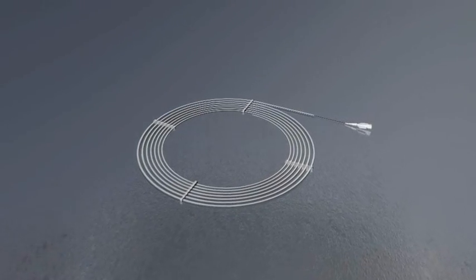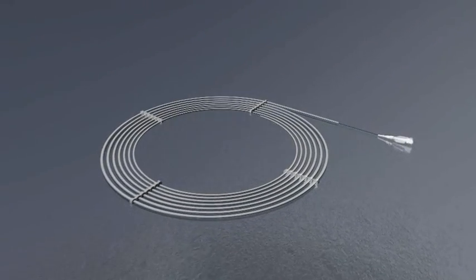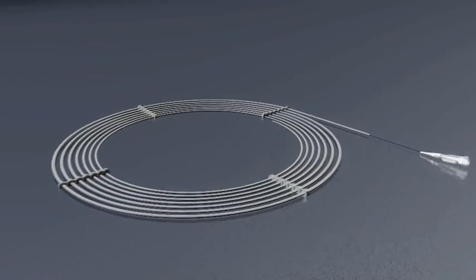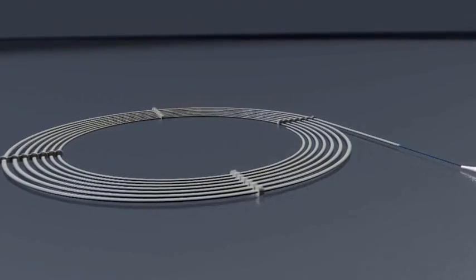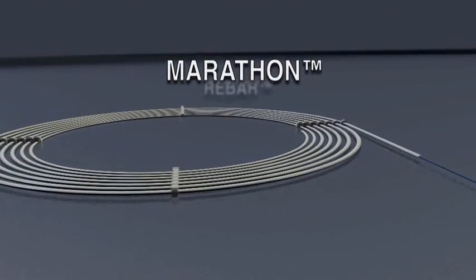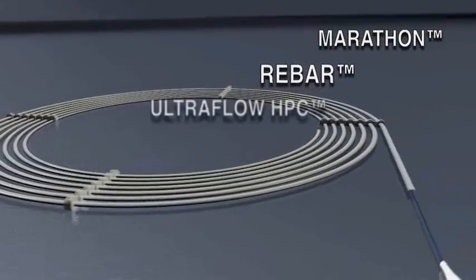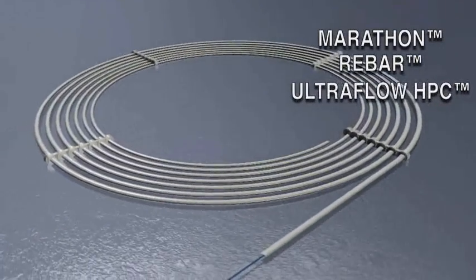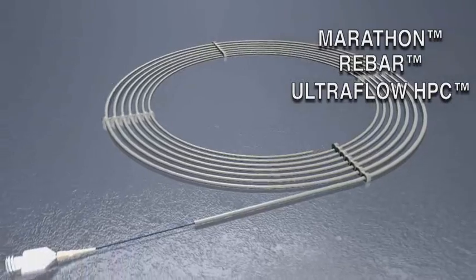A DMSO compatible delivery microcatheter indicated for use in the neurovasculature, for example, the Marathon, Rebar, or Ultraflow HPC catheters must be used to access the embolization site.